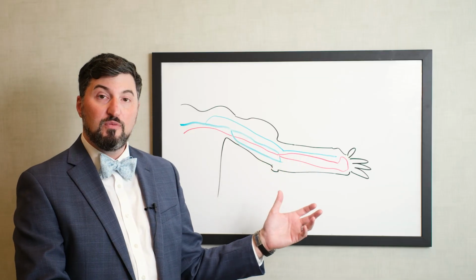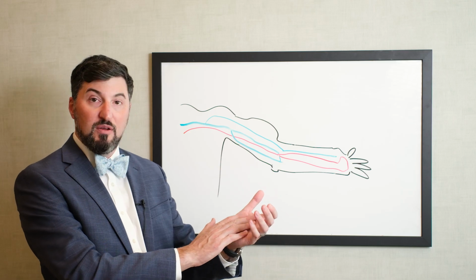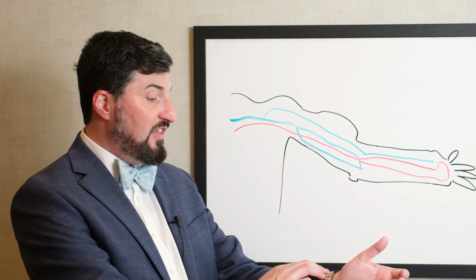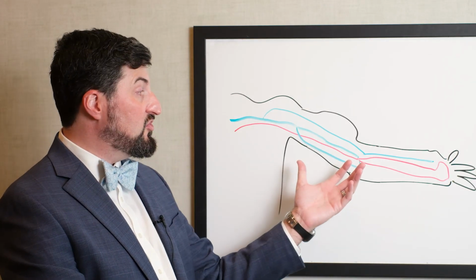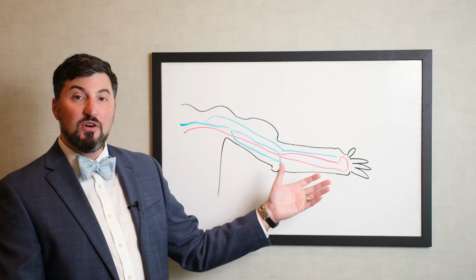And that's the first choice because it's the furthest down the arm. It has the lowest probability of taking blood flow away from the hand because it's down in a smaller artery. And as that vein grows and matures, and as that fistula keeps humming along, it's actually maturing and helping slowly grow all of the veins higher up in the arm. If that vein's not any good, that's okay.